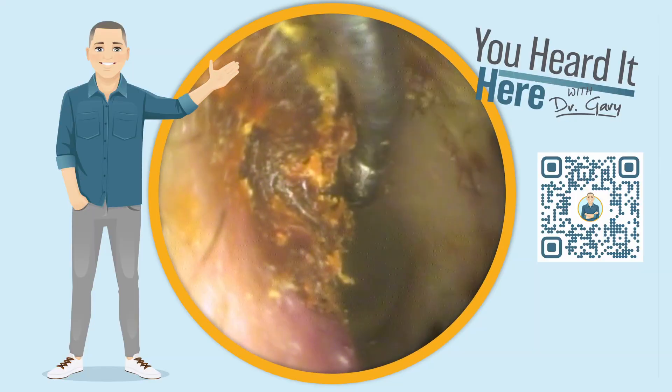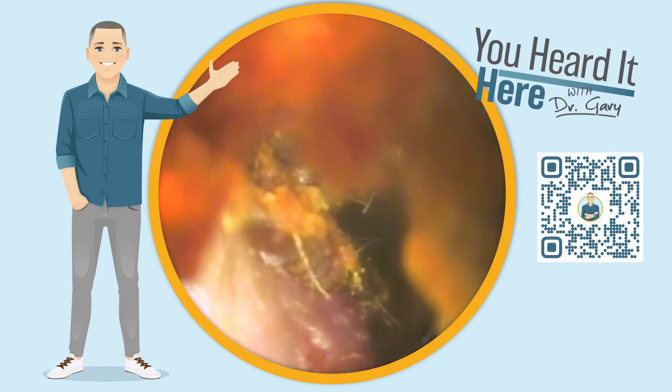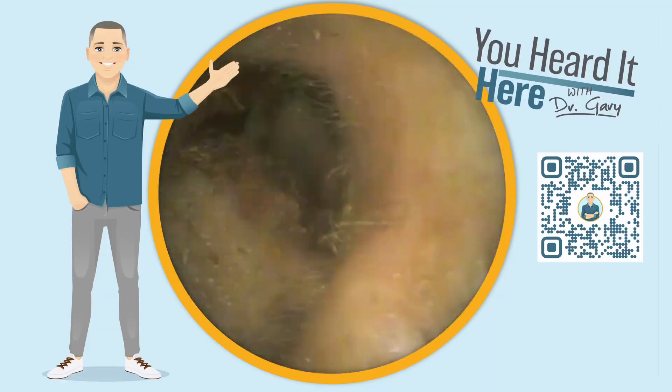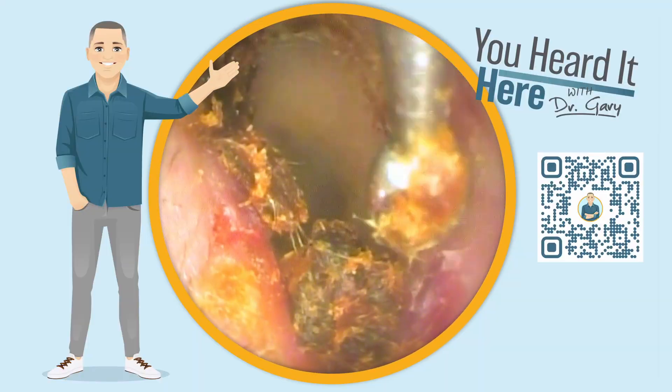We still have some wax at about the one o'clock position in the ear canal, so let's see if we can get that out. I'll show you what's come out of this patient's ear so far — you can see it breaking up into these large chunks.